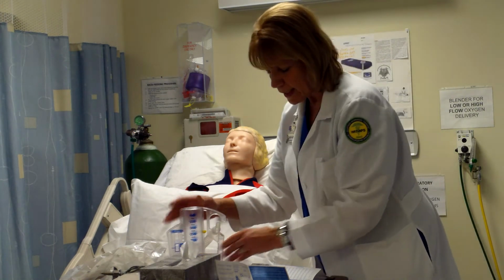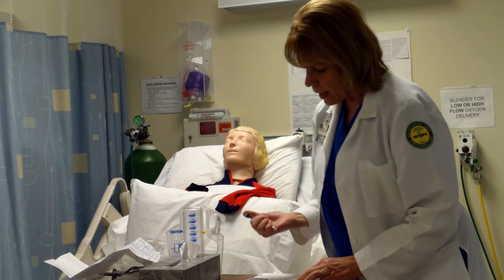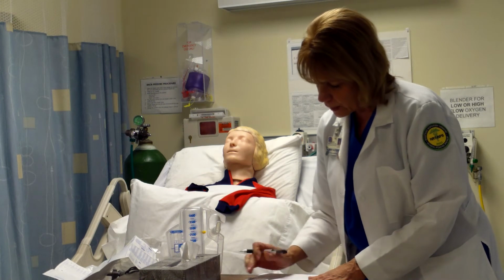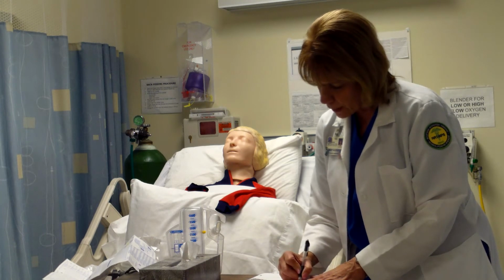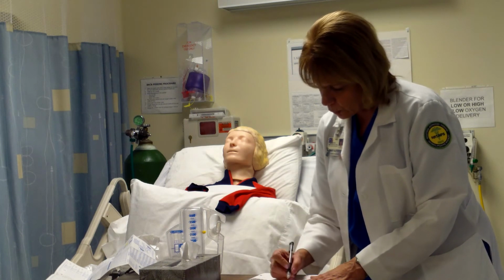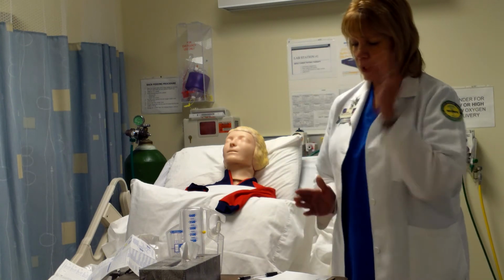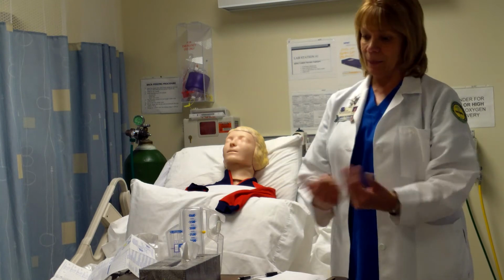Okay, now if 2,600 is my goal, then, because I'm a good therapist and have a calculator and my notepad, I'm going to figure out what 80% of that is and what 33% of that is. So 2,600 times 80% and 2,600 times 33%. 80% would be 2,080. 2,600 times 33% would be 858. Okay, so if it's over 80%, then I'm just going to continue to encourage deep breathing and coughing. If it's between the 33 and the 80, it would be incentive spirometry, and if it's less than 33%, then I need to consider IPPB therapy.